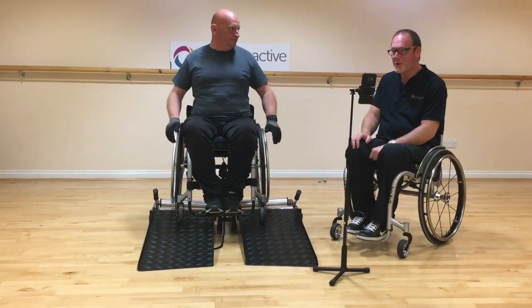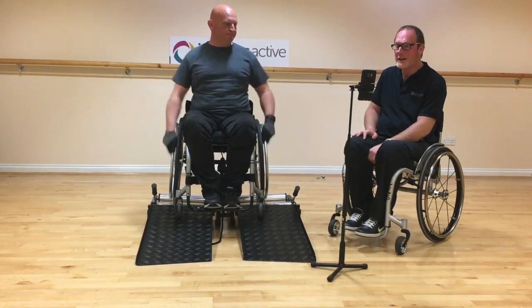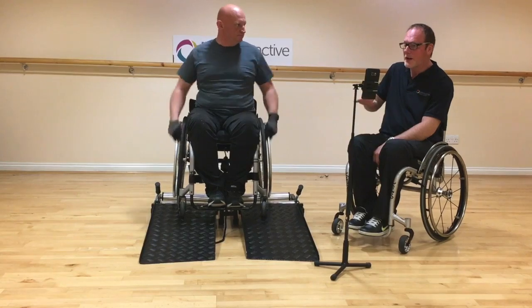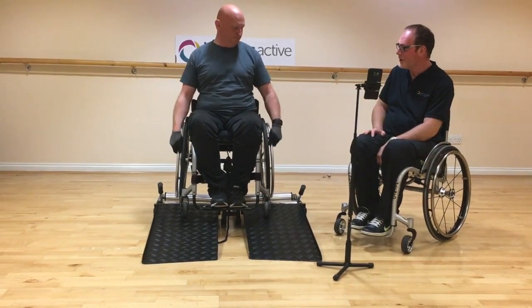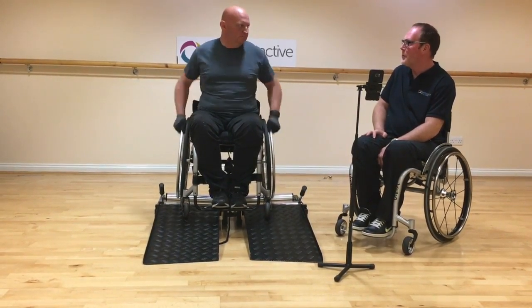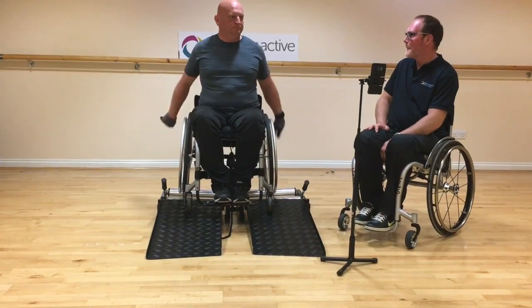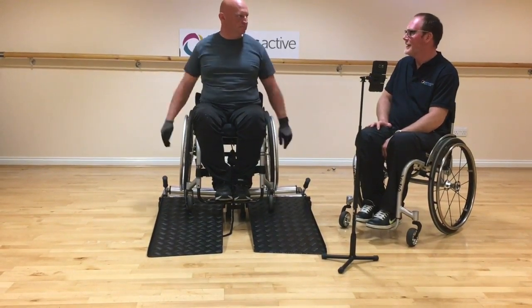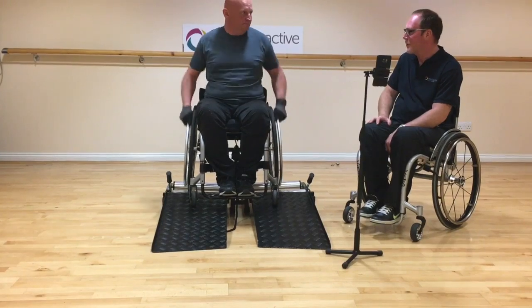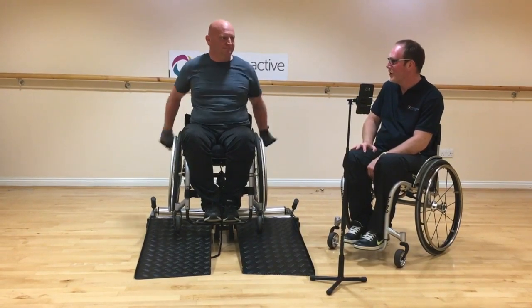That's fantastic — first go, 5 minutes at 3 miles per hour, well done. Now slow the pace down to lower your heart rate — we're going to do a bit of a cool down. One thing I'll ask you to do as your heart rate lowers is to wheel backwards. I always like to do that after a workout because you're using a totally different muscle group. Wheelchair users tend to develop shoulder injuries through constant use of the same muscles, and it's not often you get the chance to wheel backwards — this is a great opportunity to use a different set of muscle groups.